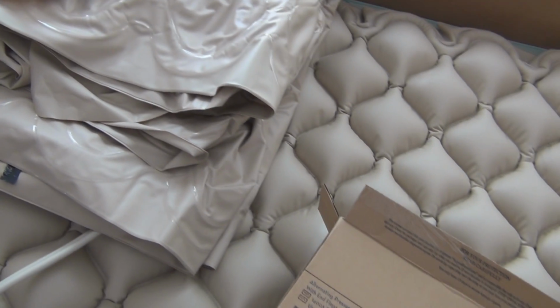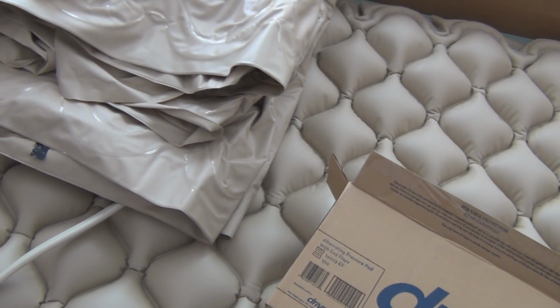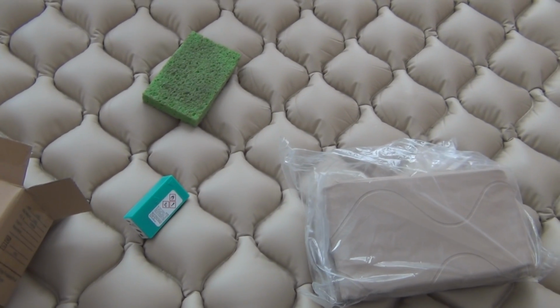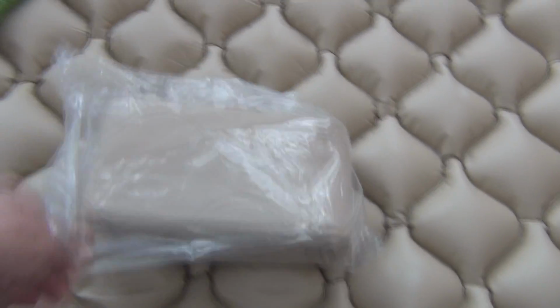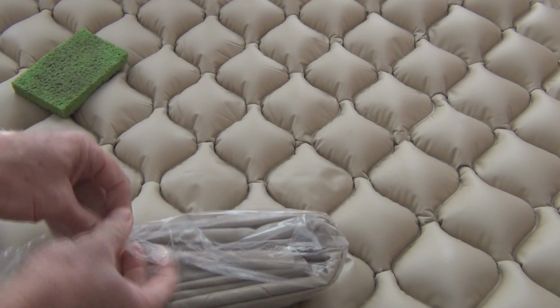Now that I have two, I did order a repair kit off of Amazon also for inflatable mattresses. I don't know how long it takes for that stuff to cure. That was another thing, or how long the patch is going to last. So I just went ahead and ordered this. So let me go ahead and hook this up. So let me get this out of the bag here.